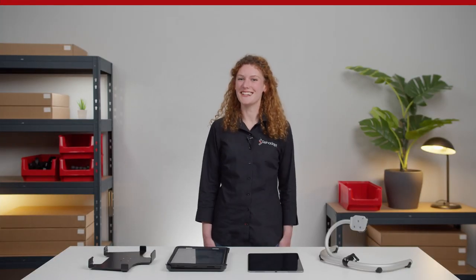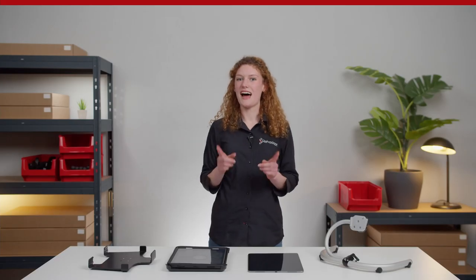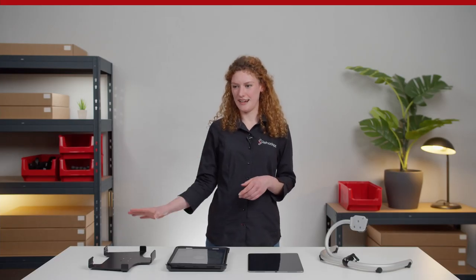Hi guys! Welcome to a new episode of Mounting Made Easy. I'm Nadine from Rehadapt. In today's episode, I will introduce you to our cradles for iPads.